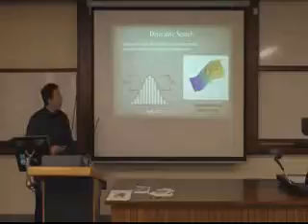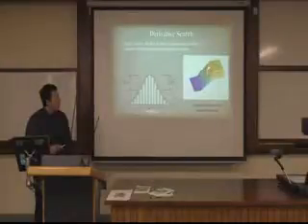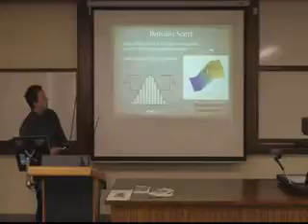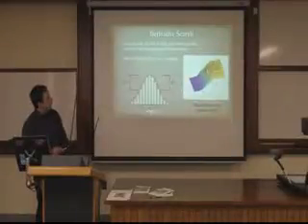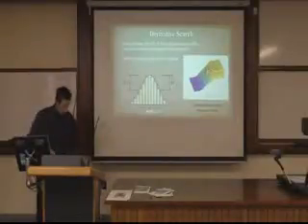And so how I find the intensity value within a fiducial marker is, if you imagine this as a pixel intensity profile, here's the topography of a fiducial marker, and you're basically looking for a derivative that has the consistency of a fiducial marker. And you have to do it in both UV directions. U and V refer to pixel coordinates, U across, V down, because you don't know which way a fiducial marker is going to be oriented in the image space.